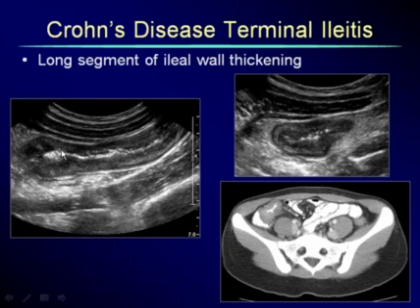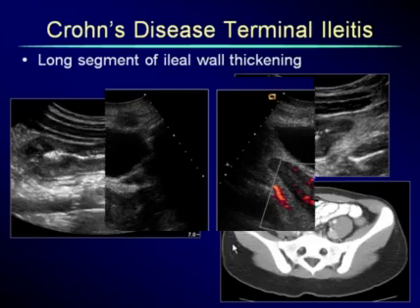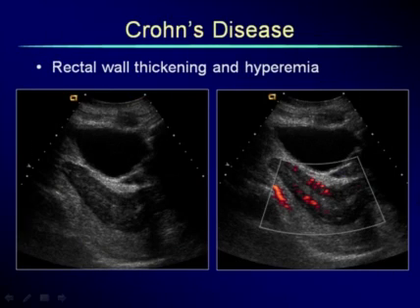This patient with chronic right lower quadrant pain had this long loop of thick-walled bowel right under her abdominal wall. It went on and on and on. It continued. This was not an appendix. It has bowel signature, but it's not the appendix because it was not blind ending. We turned on it. It looks like bowel. It correlates beautifully with the terminal ileum, which is very abnormal here, causing edematous impression into the cecum. So this is Crohn's disease terminal ileitis.